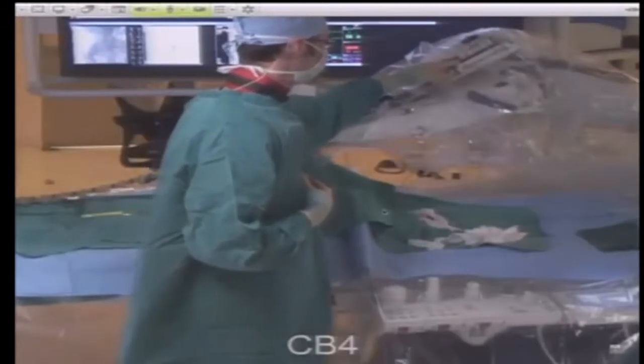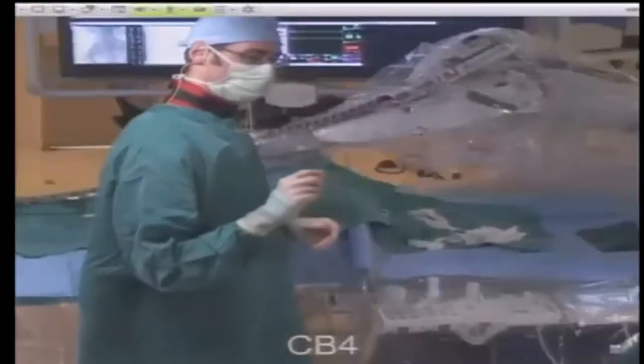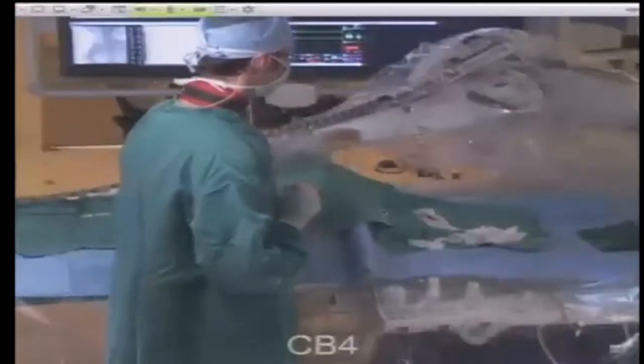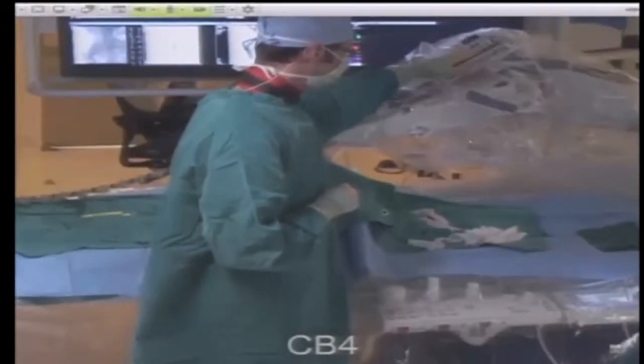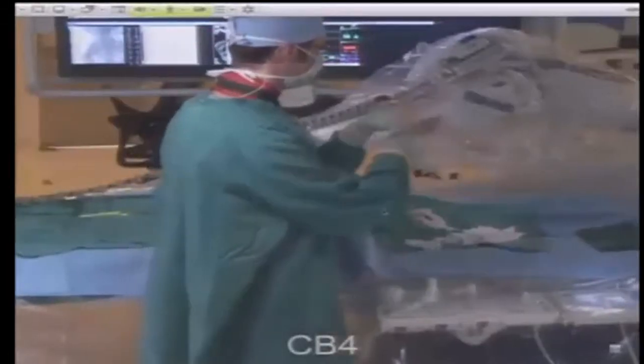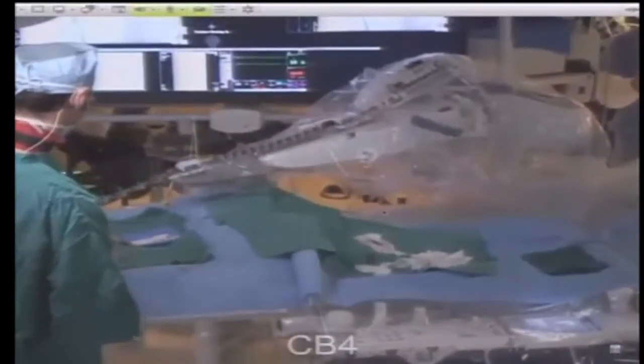The other component you may be able to see up here is the guide wire manipulator. Generally, when we manipulate a wire, we do so with our fingers or with a torque device that locks onto the wire. This does that same function. There are essentially two belts that guide the wire both forward and backwards and also rotate it, so the two plates transition across each other. And that's the bulk of the robot.